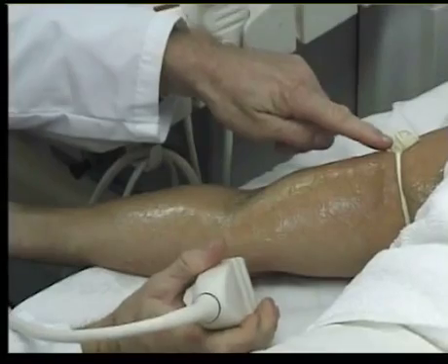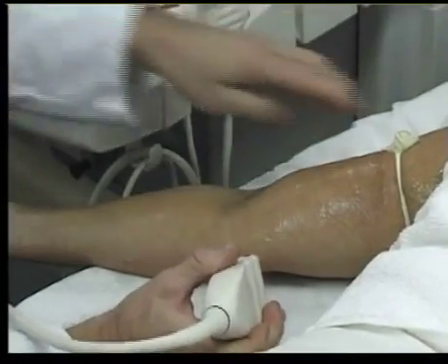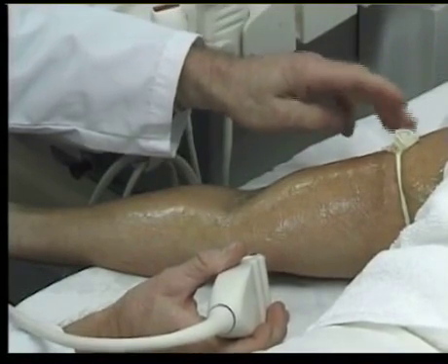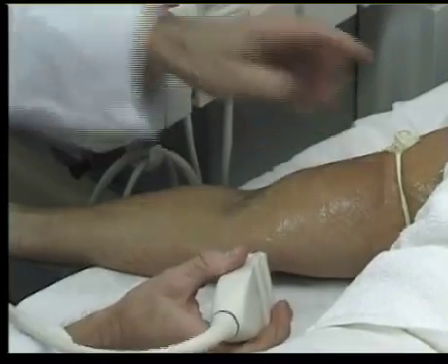A Penrose drain works nicely for a tourniquet. And the upper arm is just primarily for the superficial veins. We don't want to get it too tight so it shuts off the deep veins. But in this case, if you don't have a Penrose drain, sometimes a large latex rubber glove will work as well.